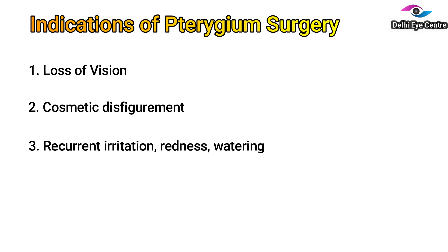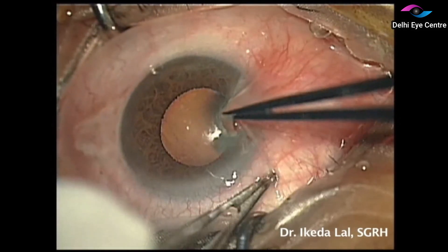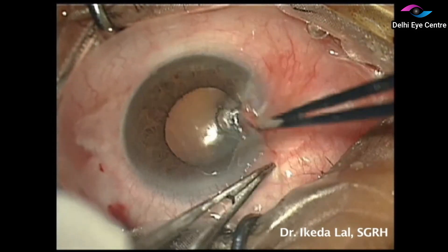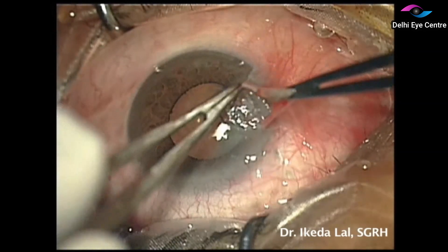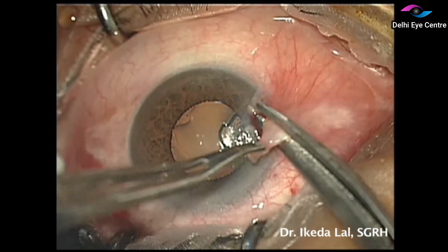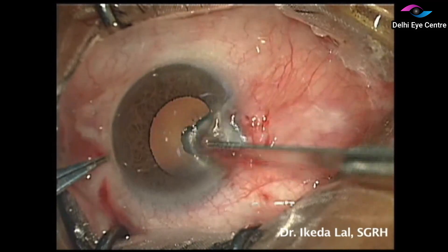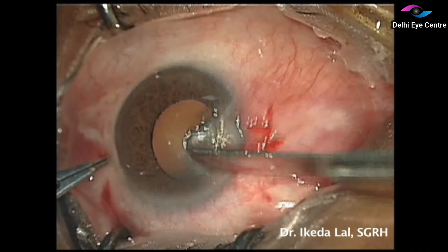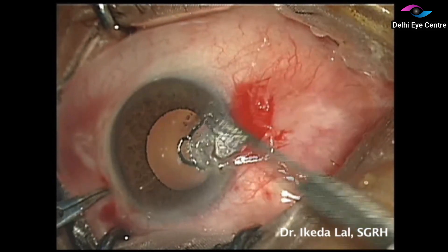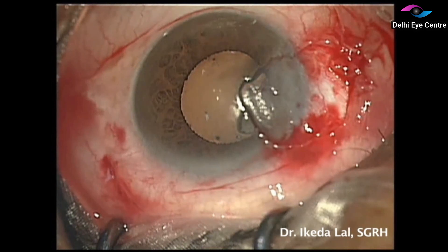Now let's look at the surgical video. First, we are stripping the pterygium head from the corneal surface. This is being done with the use of two sharp forceps. Then the head of the pterygium is being excised. Here we are clearing the cornea, making sure that we achieve a smooth dissection without any residual tissue on the corneal surface.